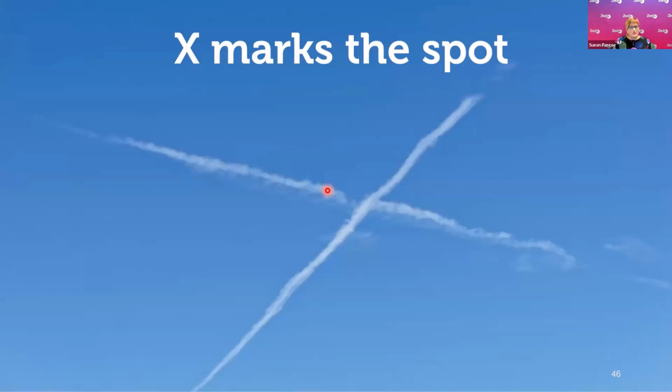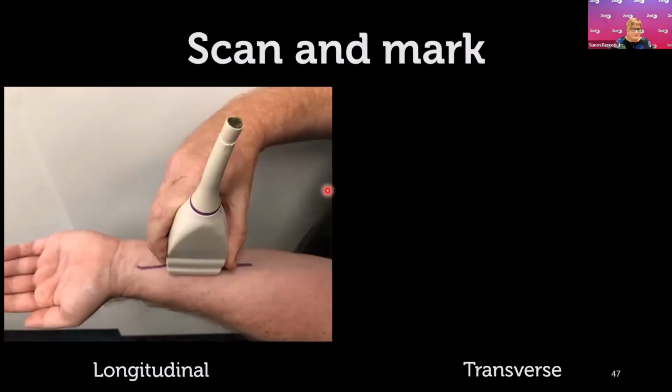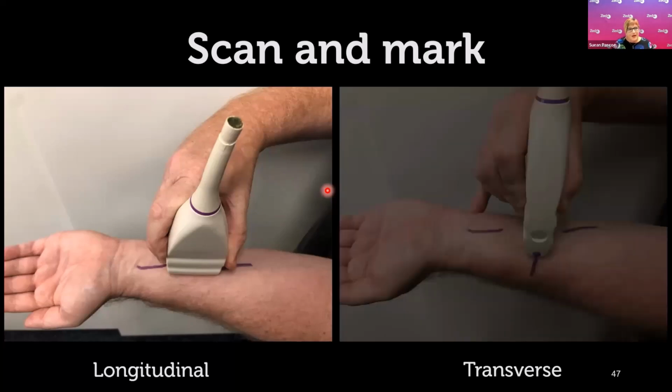So once we've measured that for an object and we know where it is and we can geolocate it, now we need to do an X marks the spot to figure out how, if you are going to do a surgical procedure, you can cut down on it. So the way I go about doing this is I find the longitudinal axis of my foreign body, and I pop the probe on like this, and I use the texta pen to mark at each end of the probe.